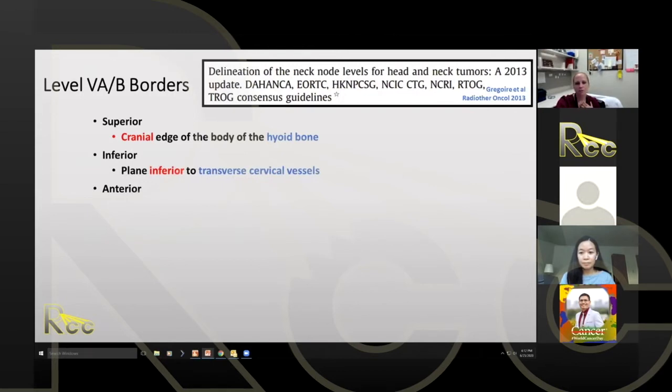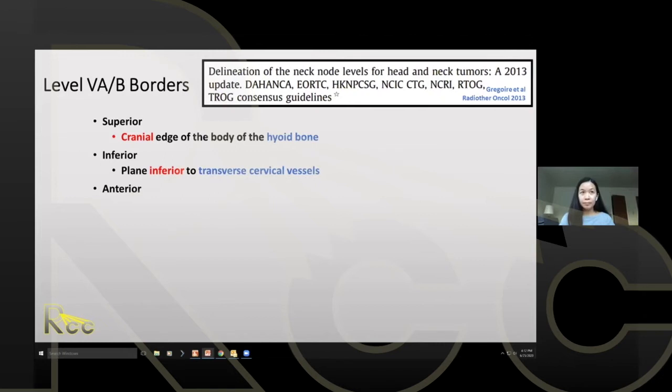So all of these lymph node stations, when you look at the definitions, I think it's important to realize that the definitions have evolved over time from surgical-based anatomy to two-dimensional imaging anatomy, and now to 3D imaging anatomy. The answers we were given before came from surgeons dissecting the neck, who traditionally felt they were dissecting all the way up to the skull base.